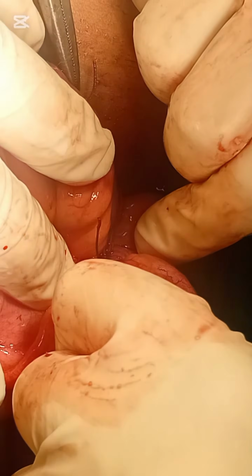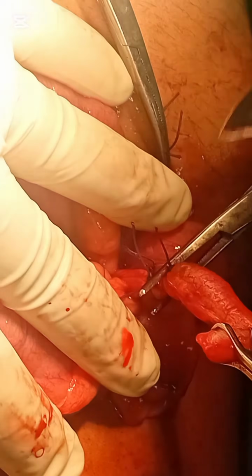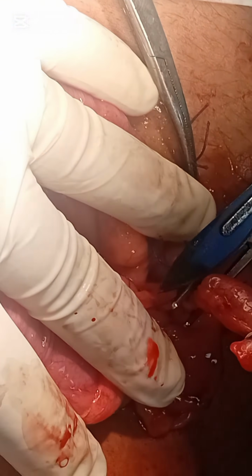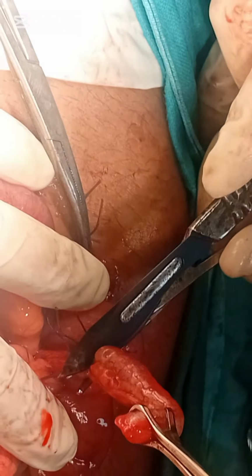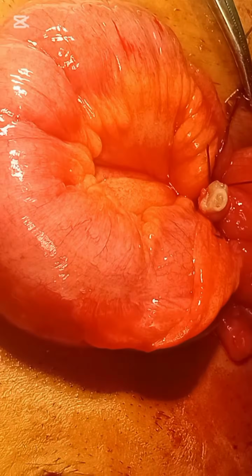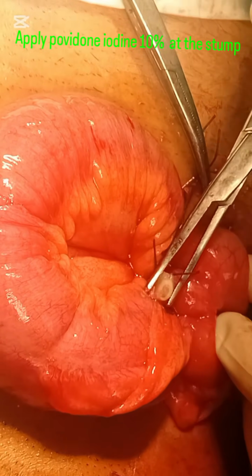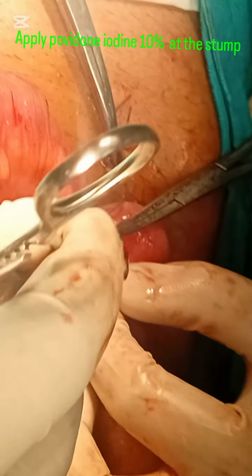Now cut the appendix just above the crushed area with the scalpel at right angle to the appendix. The appendix is separated. You can see the base where we have cut is now soaked with povidone iodine, so the fecal matter or the bacteria get destroyed, and all the layers shall be closed sequentially to the skin.